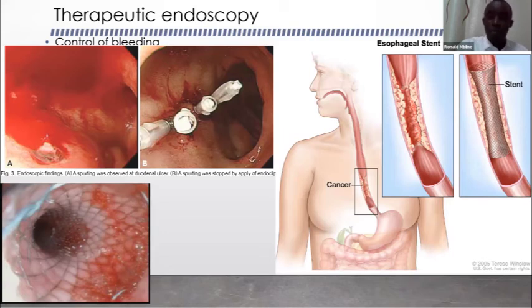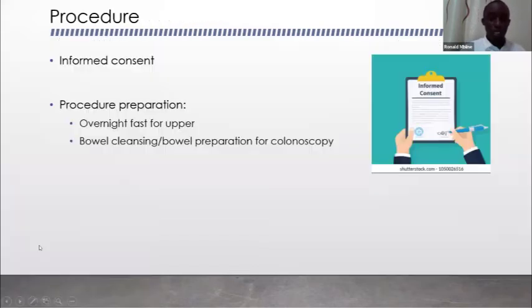This is something done for people who have advanced diseases that cannot be operated. But at least when a stent is in place, they can continue to feed and eat. The lower image is an actual stent that has been launched into someone.